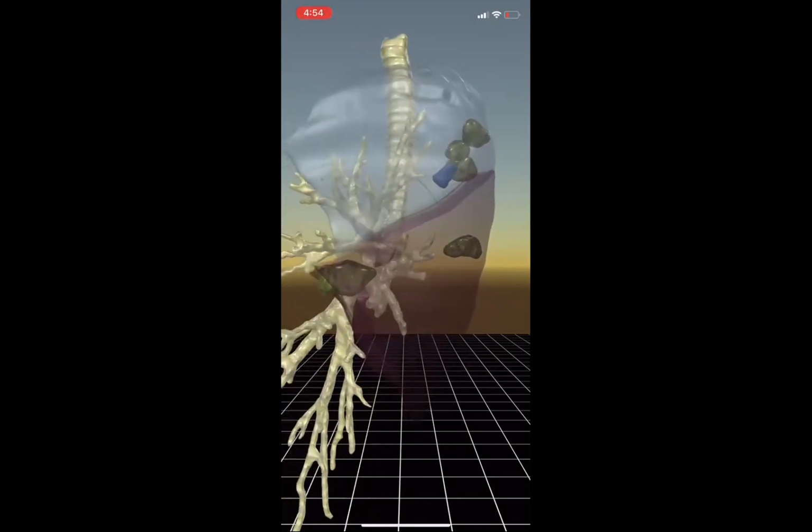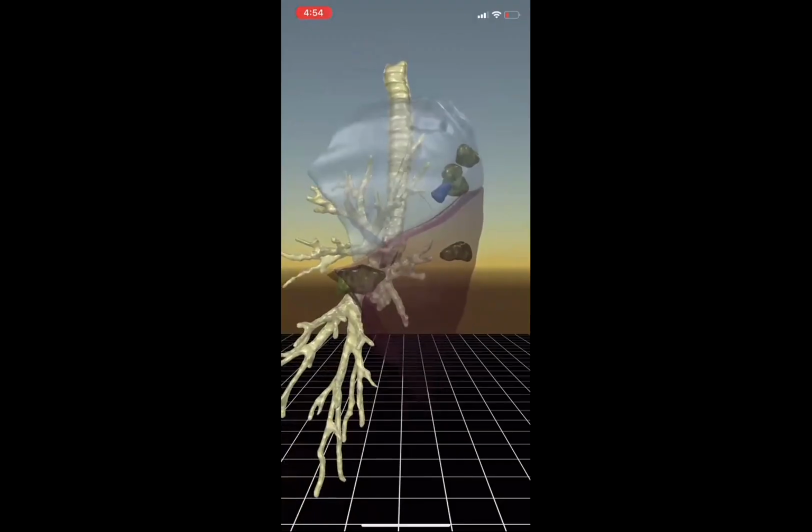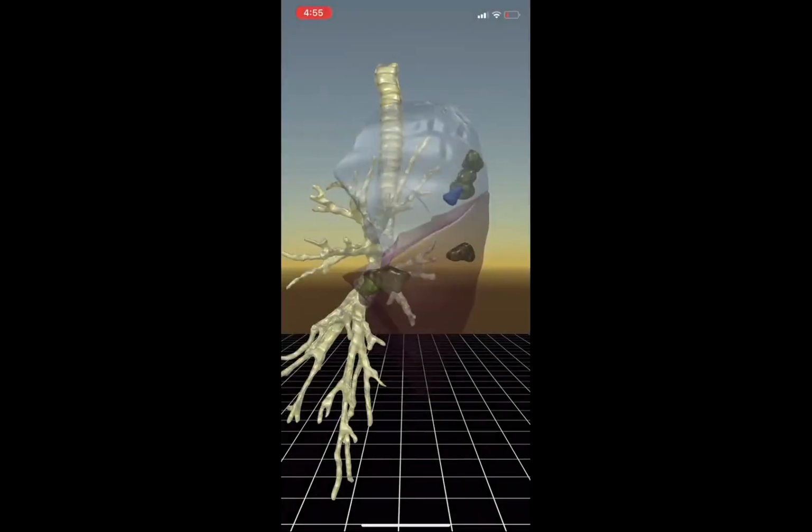It's something that's literally impossible to tell from conventional CT imaging, and it's a huge advantage to have this. Having this at the tip of my fingers, to be able to have the trainees have access to it, to be able to review it in the operating room easily, it's really indispensable to surgical planning, honestly.